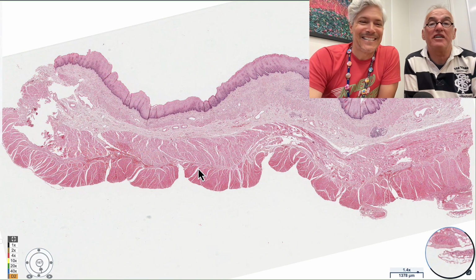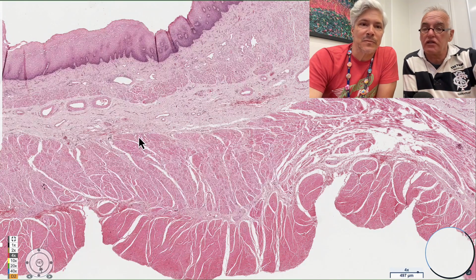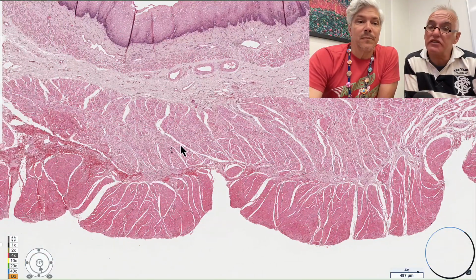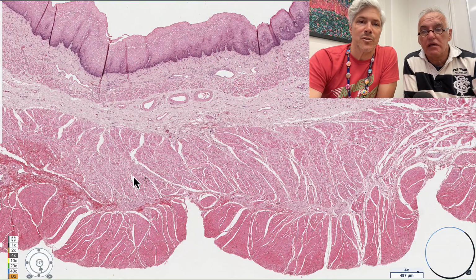Bingo. It has two names. Why use one name when you can use two? Exactly. Let's zoom in a little. And then the whole outer thing is wrapped by a serosa or an adventitia. Indeed. We'll eventually see some evidence of a fourth layer all the way on the outside, the serosa or adventitia.